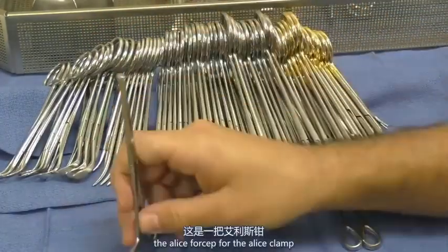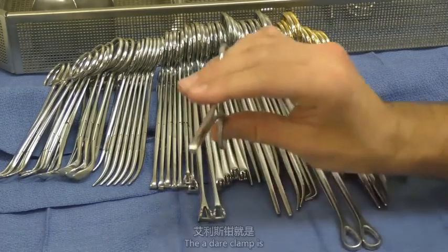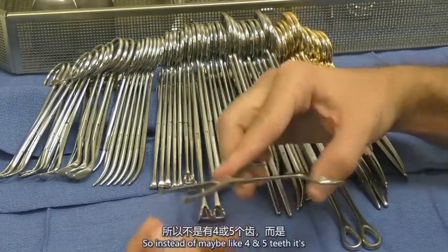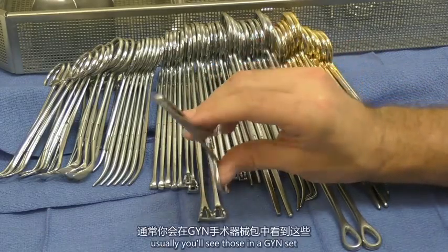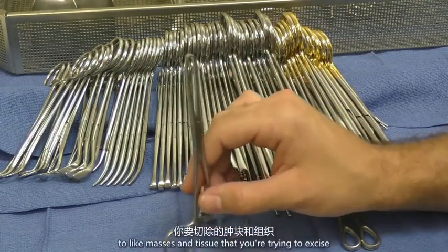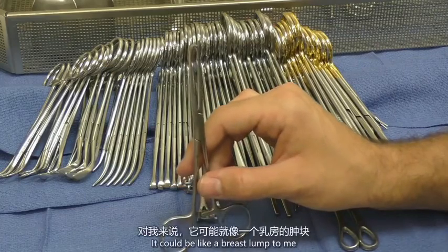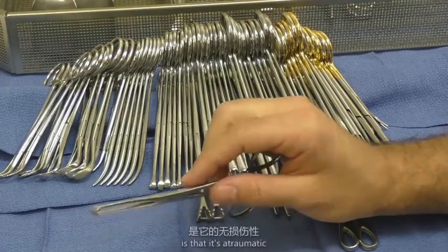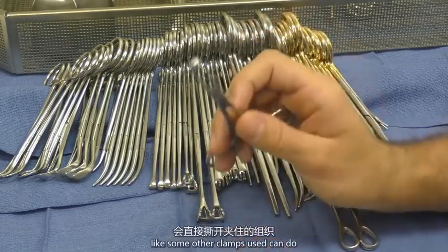Next up, we have the Allis forceps, or the Allis clamp. There is an Allis Adair clamp as well. The Adair clamp is just slightly wider. The teeth are slightly wider. So instead of maybe 4 and 5 teeth, it's like 7 and 8 teeth or something like that. Usually you'll see those in a GYN set. These are a general purpose clamp for basically holding on to masses and tissue that you're trying to excise from a wound or from a patient. Could be a breast lumpectomy, it could be a lipoma, but the most important role of this is that it's atraumatic. It's not going to just tear into that tissue like some other clamps can.